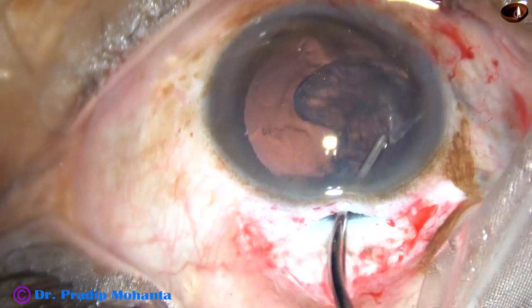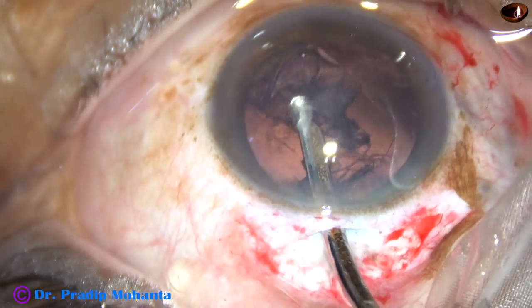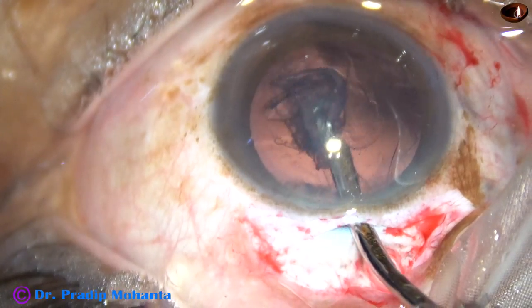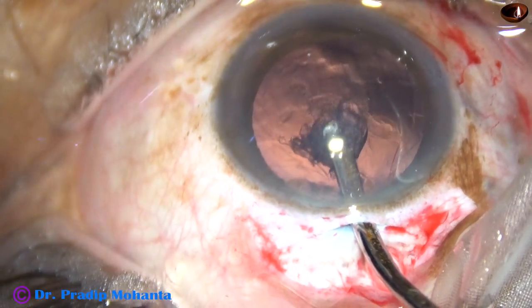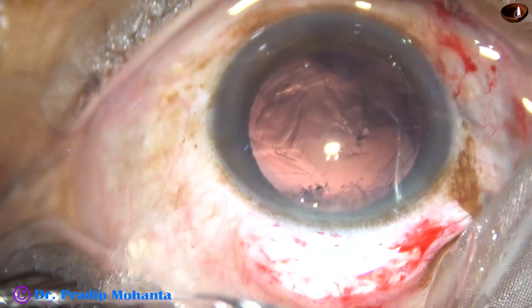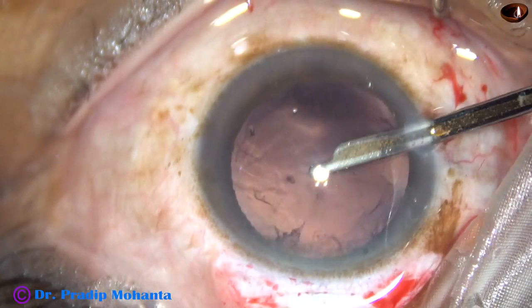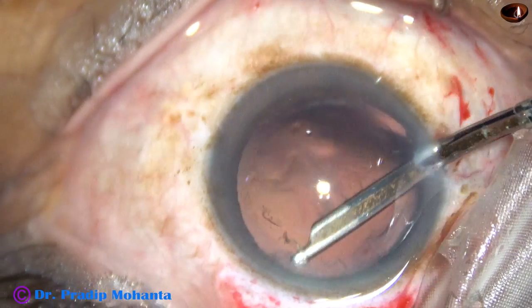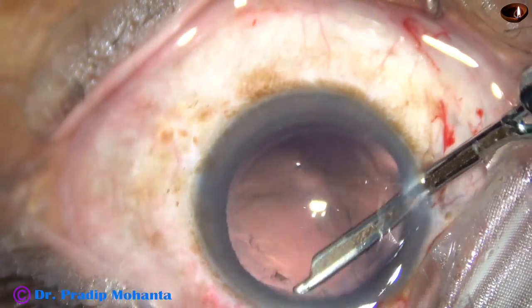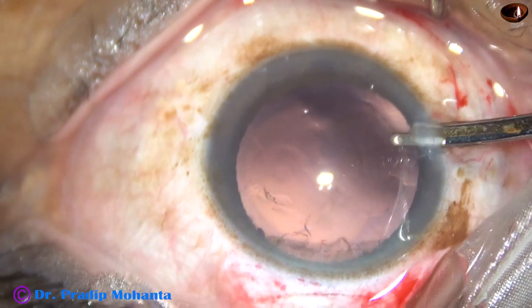This is a 23-gauge Simcoe cannula being used to remove the cortical lens matter. Most of the cortex has been removed. Now the cortex from the superior aspect of the bag is being removed going through the side port. Yes, most of the cortex has come out.